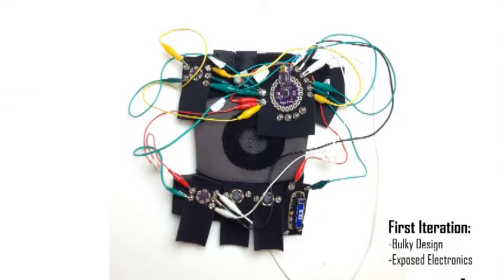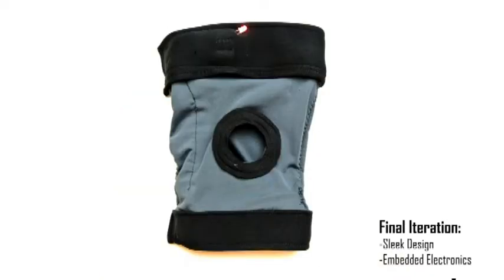By using smaller components from our first prototype of the Knee, we were aiming to increase the invisibility of our brace to the patient. This allowed us to go from this bulky design with exposed electronics to this integrated design where the electronics are hidden within the garment.